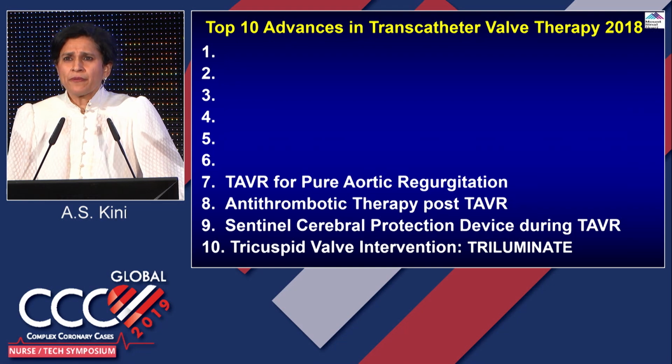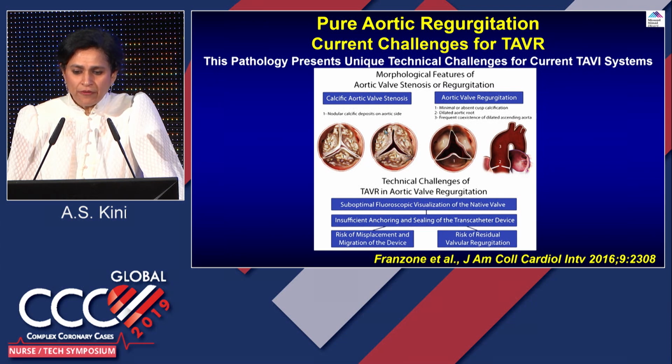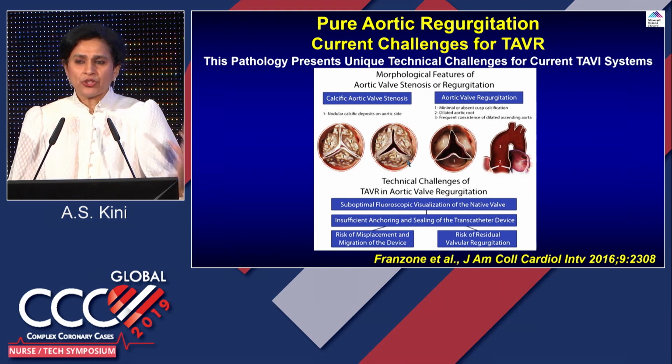Now, what is the big difference in the pathology of aortic stenosis versus aortic regurgitation is what we see here. So this is aortic valvular stenosis, which I already showed you. Why is the valve narrowed, you see that? It's the presence of atherosclerosis, calcium, everything makes this valve narrowed. You need calcium so that the valve we place is anchored and stays there.